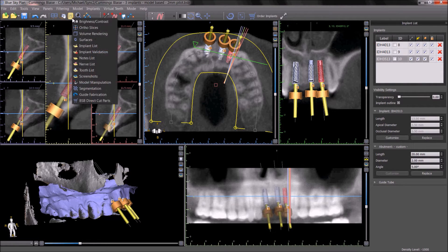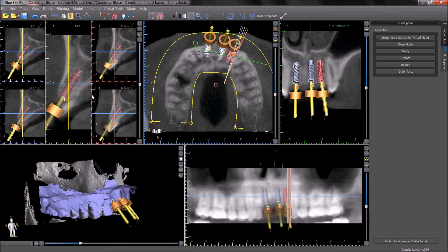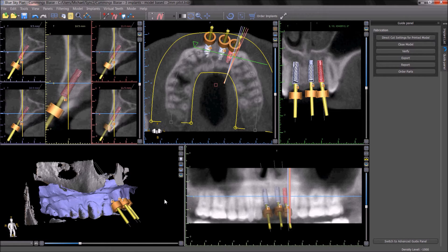The guide fabrication panel in the normal mode is a streamlined panel to facilitate the quick and easy fabrication of a surgical guide based on a model with posts and suck down technique. This technique will be explained further in a dedicated tutorial on guide fabrication based on a model with posts. The advanced software functionality for digitally designed surgical guides can be accessed by going to Mode, Advanced, or by clicking on the button Switch to Advanced Guide Panel.